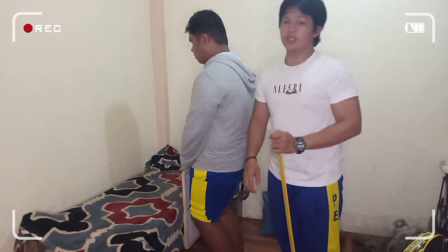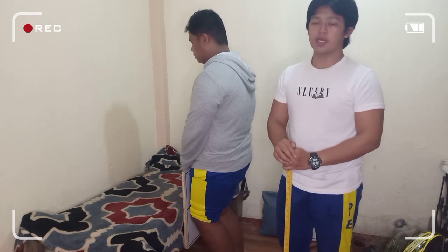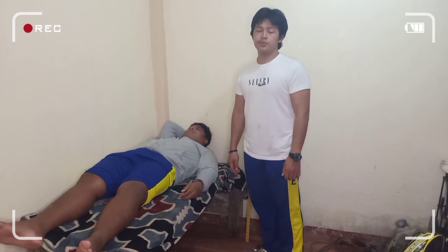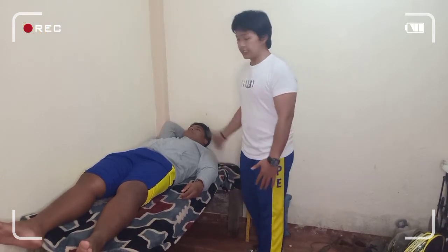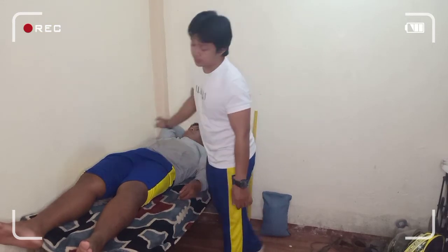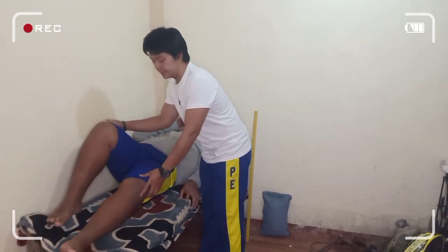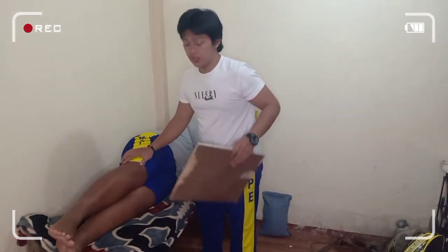The structure shown in this projection is good for evaluation of the articular cartilage disease. The second projection of the knee is the lateral projection, mediolateral. Place the patient supine on the radiographic table and ask the patient to turn on the affected side. Place the image receptor to the knee.